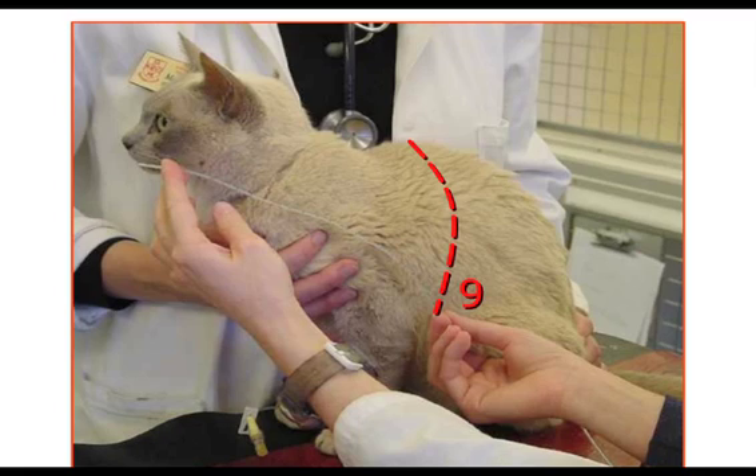What I would do first is to place the local anaesthetic in the cat's nose. One of the issues in placing NG tubes, and people who have had less than positive experience of placing NG tubes, is inadequate anaesthesia within the nose. I am guilty of this. You put the drops in — make sure you lift the cat's head up so that the liquid anaesthetic really flows through the nose. I am guilty of being impatient and not waiting long enough. So leave it long enough, and some people would actually say put it in twice: put the drops in, leave it five minutes, put another lot of drops in both nostrils, and leave it another five minutes.